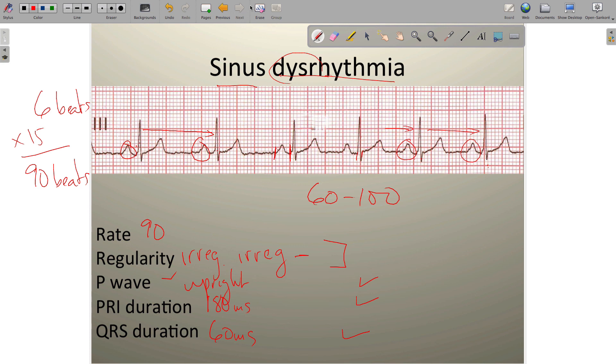That's it for the sinus rhythms — there are only four of them to know for now. In the next installment, we'll look at the atrial rhythms. Thanks.